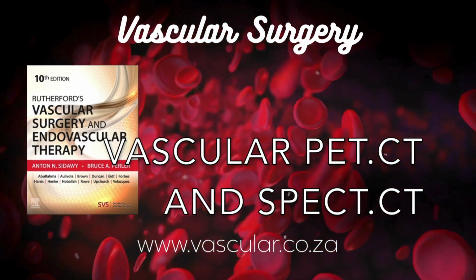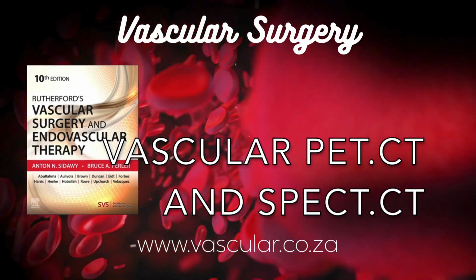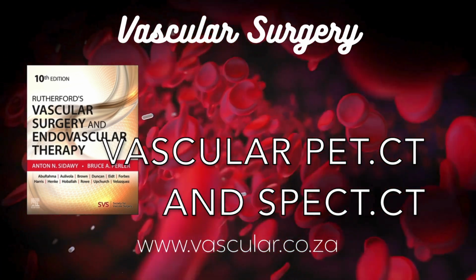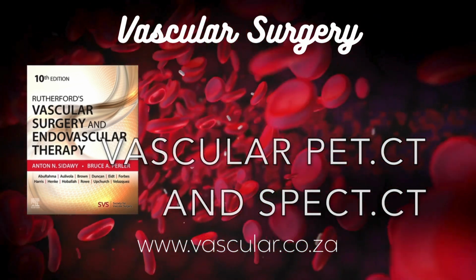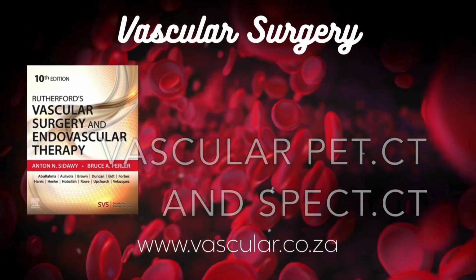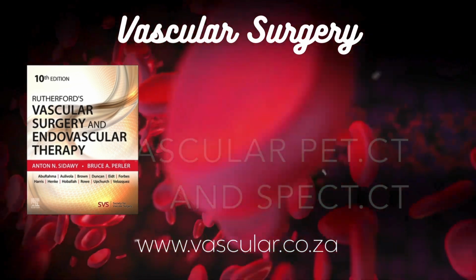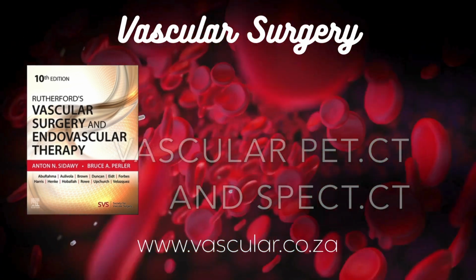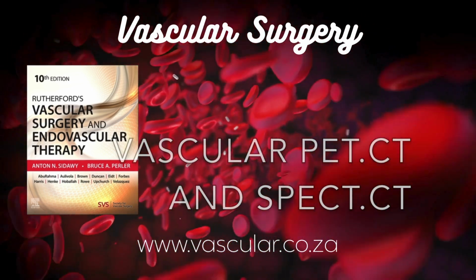Tracers for platelets or fibrin to look for blood clots within plaques. Yeah, annexin V to detect dying cells, apoptosis. Ligands for receptors found on activated immune cells like T lymphocytes, IL-2 receptors, or macrophages, translocator protein, somatostatin receptors, even tracers like choline that macrophages also take up. Matrix metalloproteinases, MMPs, enzymes that chew up tissue and might destabilize plaques. And on it goes.